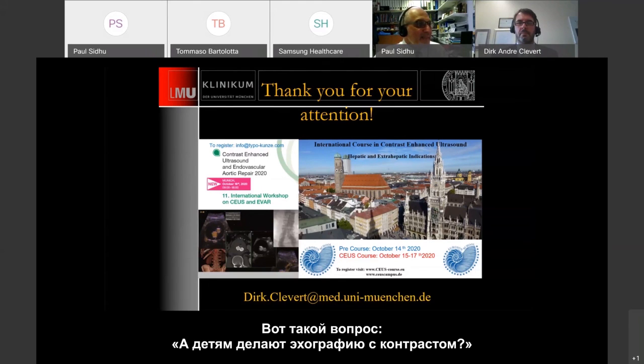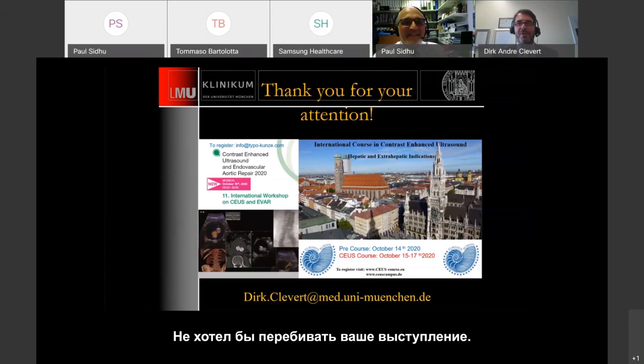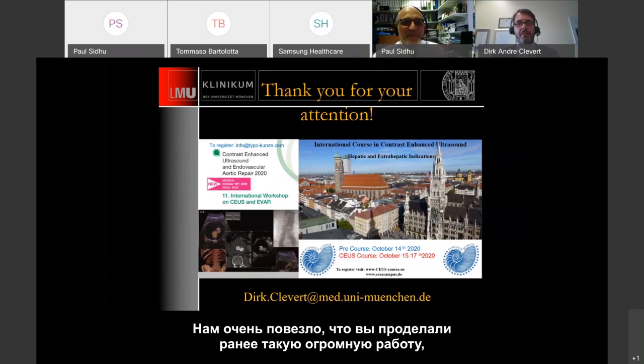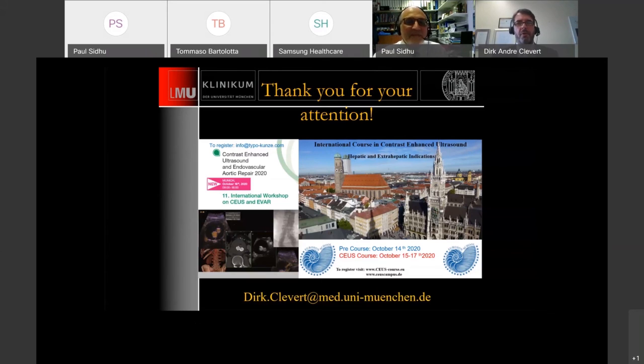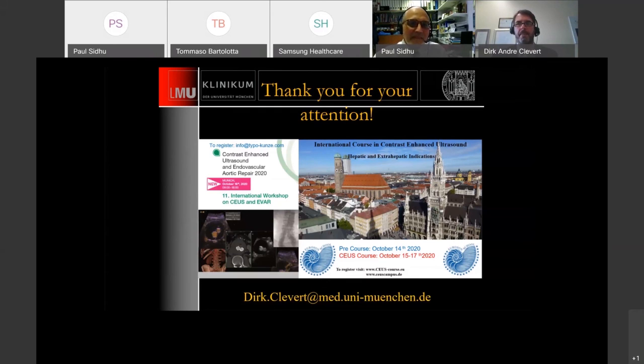I have one question from the audience, which may also be directed to me. The question is, any experience of contrast-enhanced ultrasound in pediatric patients? That's a good question. It works also in children. And I'm very lucky that you have done such great work in the past, Paul, that we have also used contrast in pediatrics. But keep in mind, the dose will be a little bit different, but they're similar.